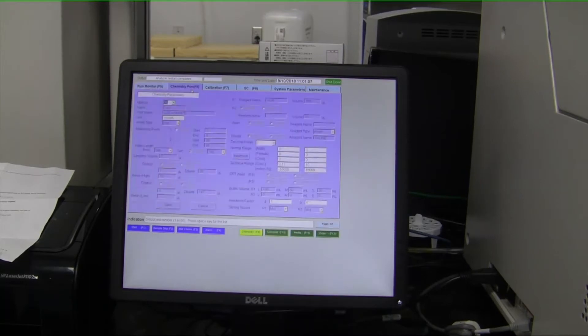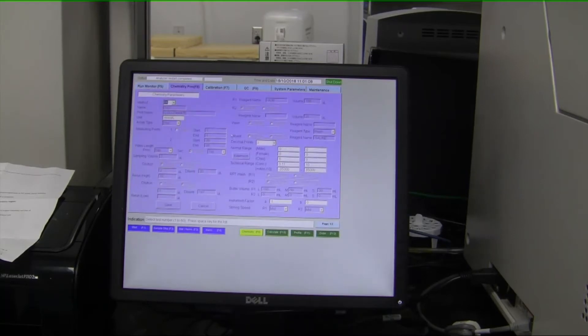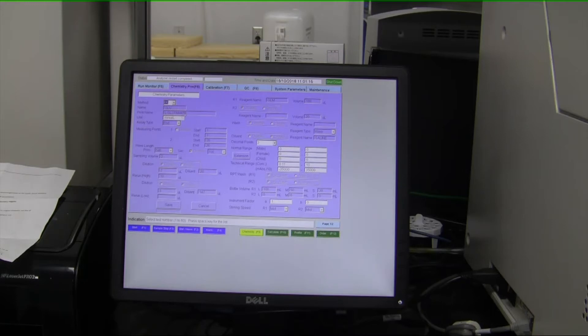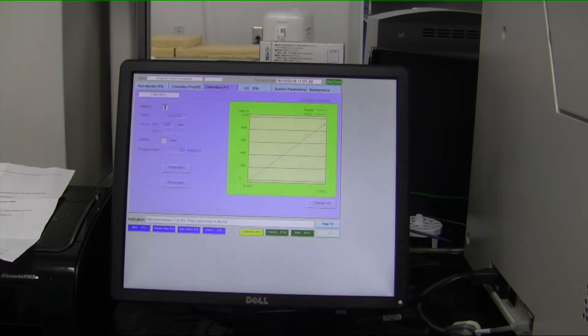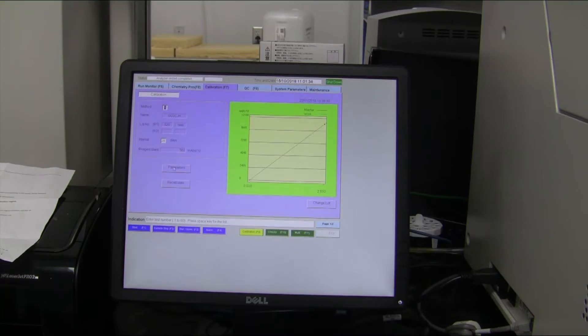If you wanted more advanced information about what the machine is doing in background, chemistry parameters will tell you all about each specific metabolite, what its measurement units are, how much sample and how much reagent is being put into the cuvette, and what specific optical frequency the measurement is being done at. But this is all things that are being done in the background of the instrument. Under calibration you'll have your calibration curves, and under parameters you're able to enter in your calibrator values.